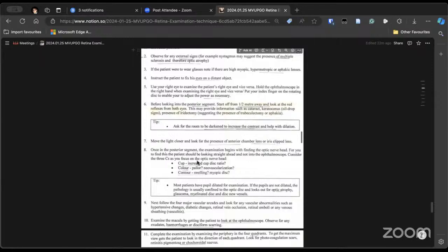The same question can be asked as how far is the blind spot from the fixation? Where is the blind spot located? 15 degrees. Yes, 15 degrees. So the answer is 15 degrees. You will place yourself so that you are going at around 15 degrees, that means 10 to 20 degrees from the visual axis of the patient.